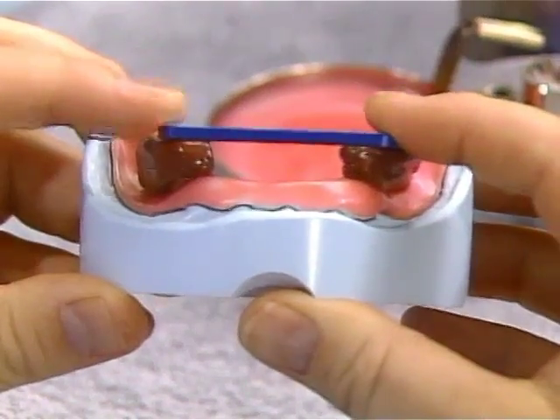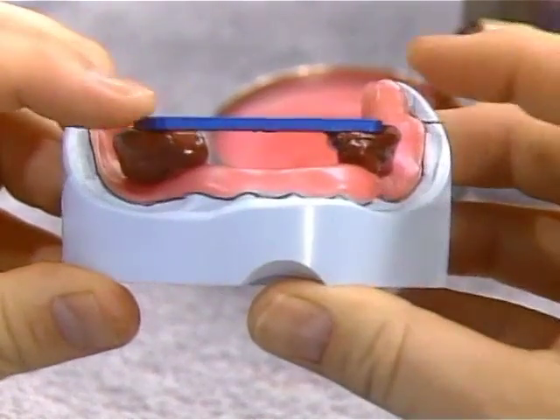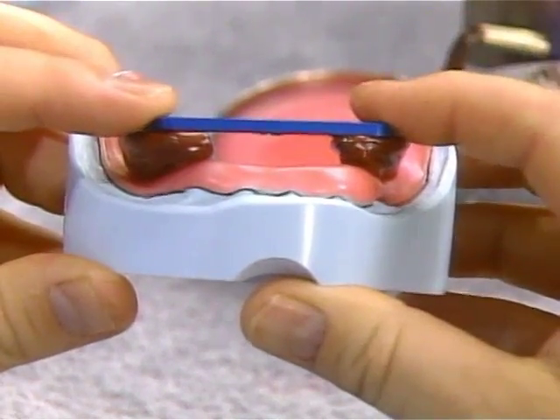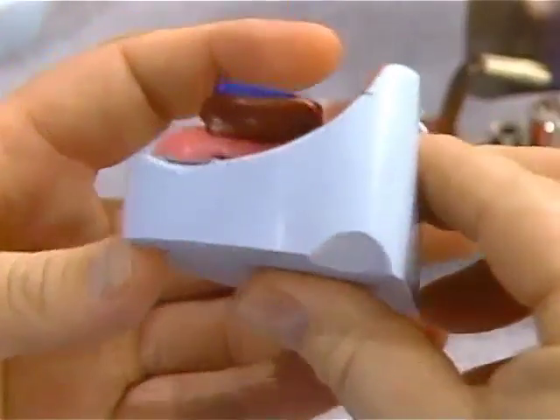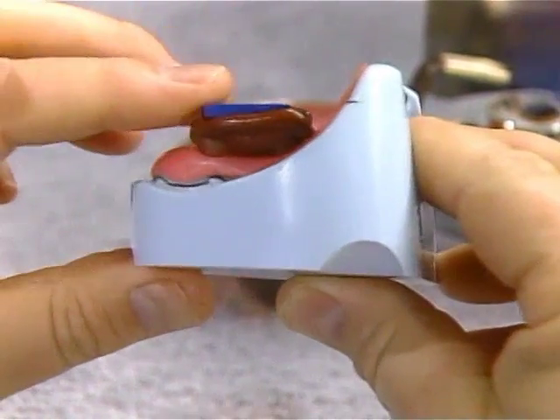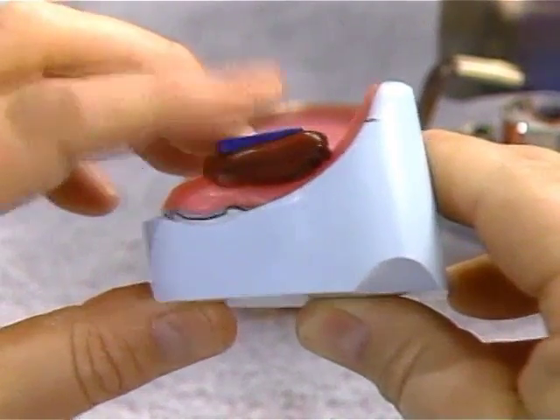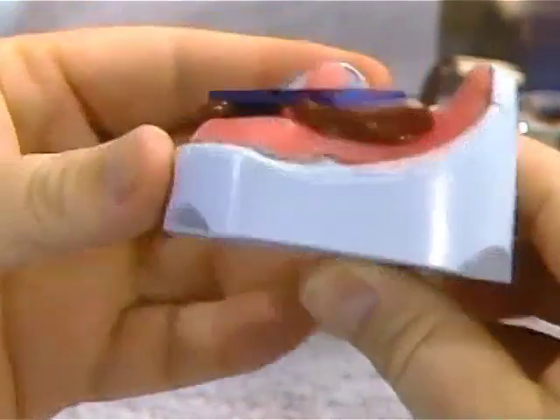Press the bar down into the compound until the top surface of the bar is level with the bottoms of the retromolar pads. Looking from the buccal, adjust the bar so it is generally parallel with the crest of the ridge. It should tilt upward and back. Looking from the anterior, make sure the bar is level.